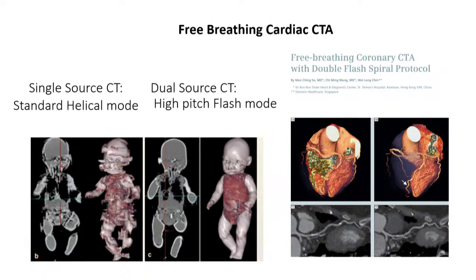And needless to say, people are taking advantage of that, for instance, to image babies. Here they put a doll in a rocking chair. And that's what we were talking about the other day, when you have a very chaotic rhythm where you cannot really come up with a specific pattern.